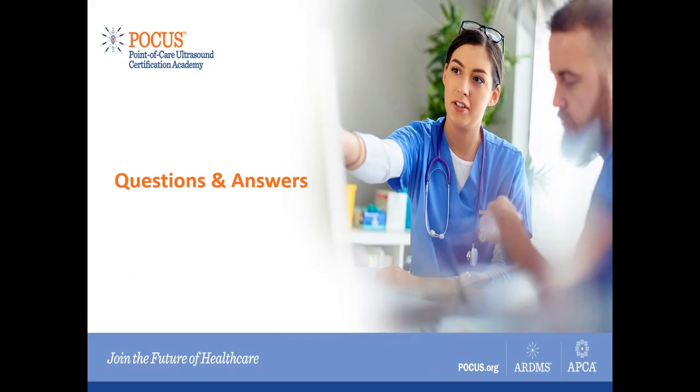We have had a couple of questions come in, one of which actually came in prior to the webinar. And so I want to share that one first and see if we can get your feedback on it. The question is, is it possible to get a clue regarding AAA during an echocardiography?